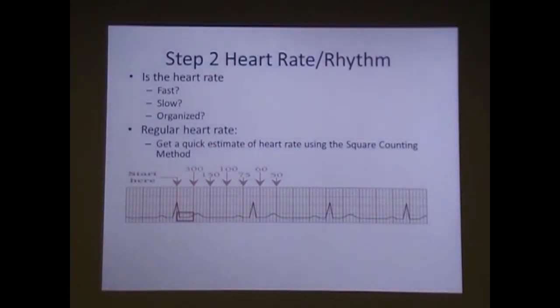So if you have time and you're in the back of the bus just screwing around wasting time, watch when they're having PVCs. Get used to what that pleth is doing and how it's different. And if you lose your EKG, your wires somehow get cut, something, it's a nice lifesaver. I use it a lot when I'm in doubt of what's going on with the heart rate.